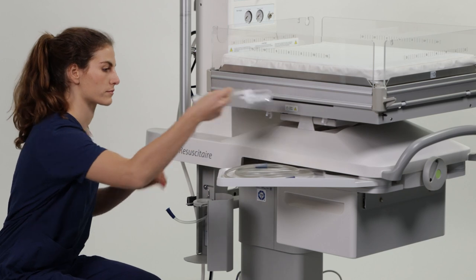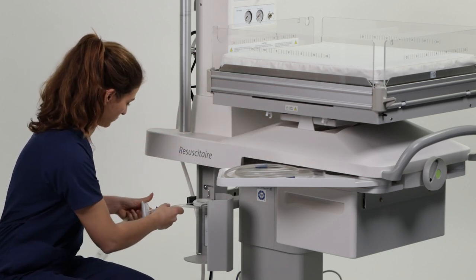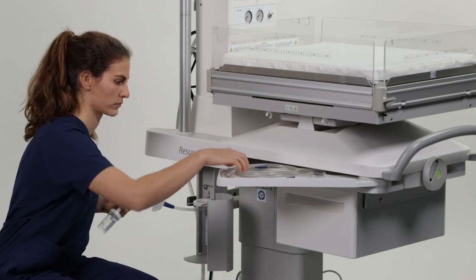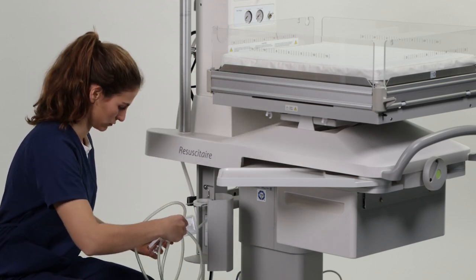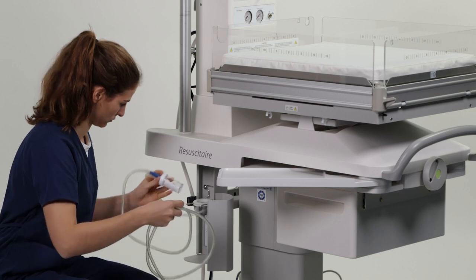The suction system is connected to the suction canister on the side of the Resuscitaire VHA or fixed height stand. The suction tube is supplied with the device but can be interchanged.